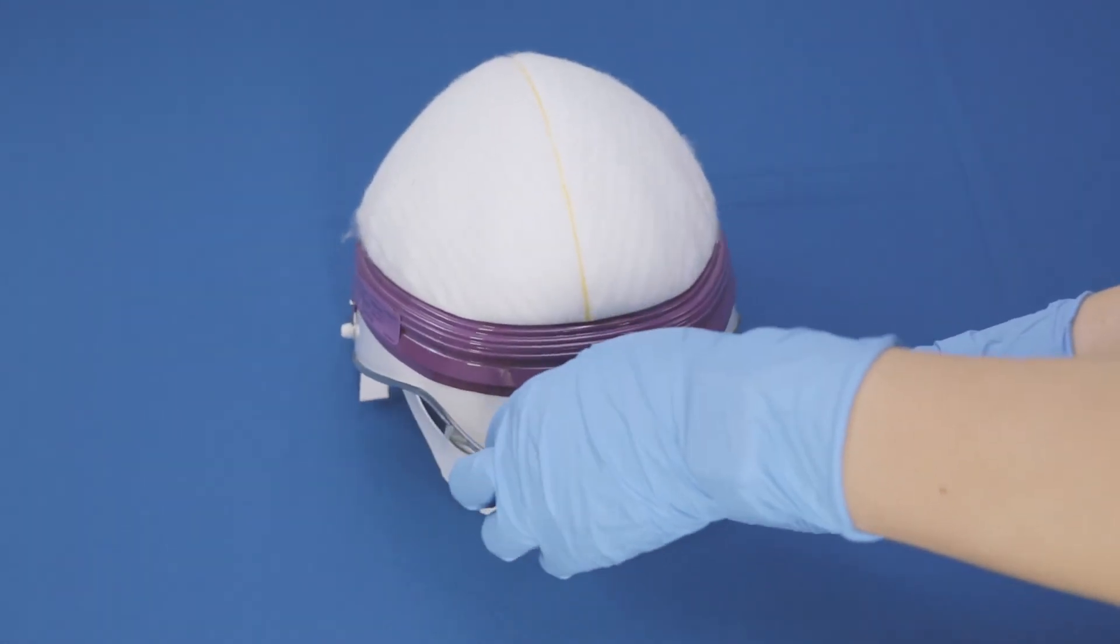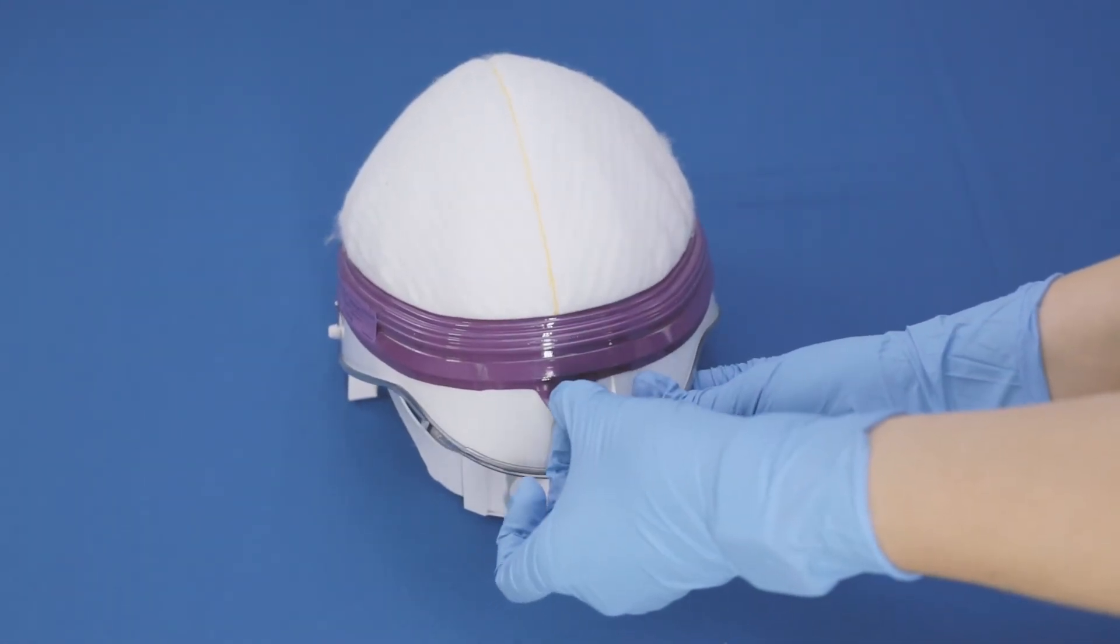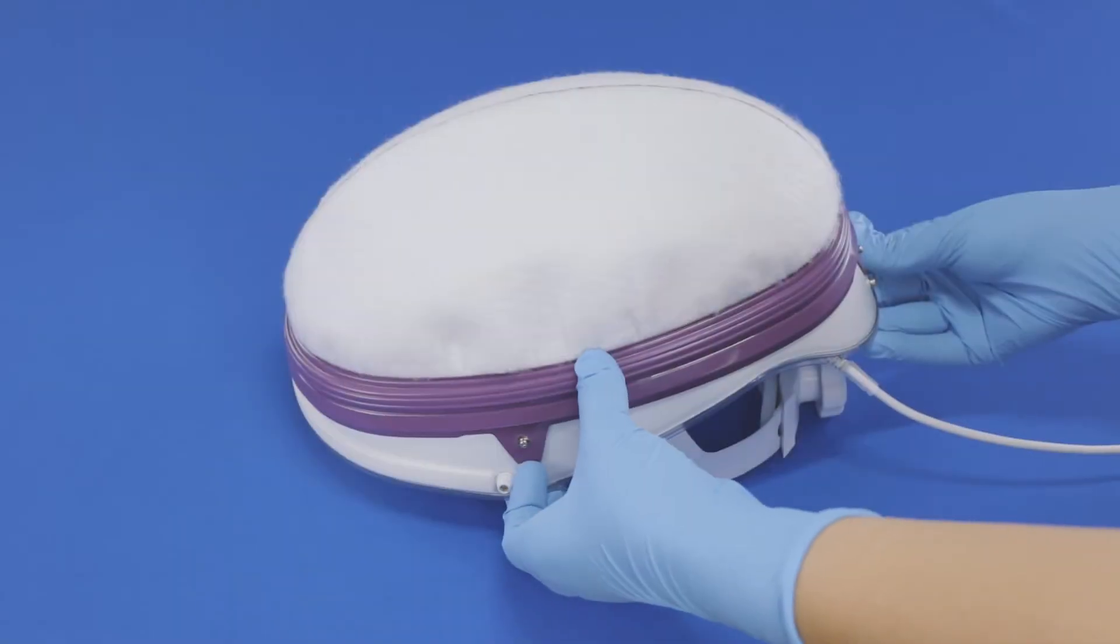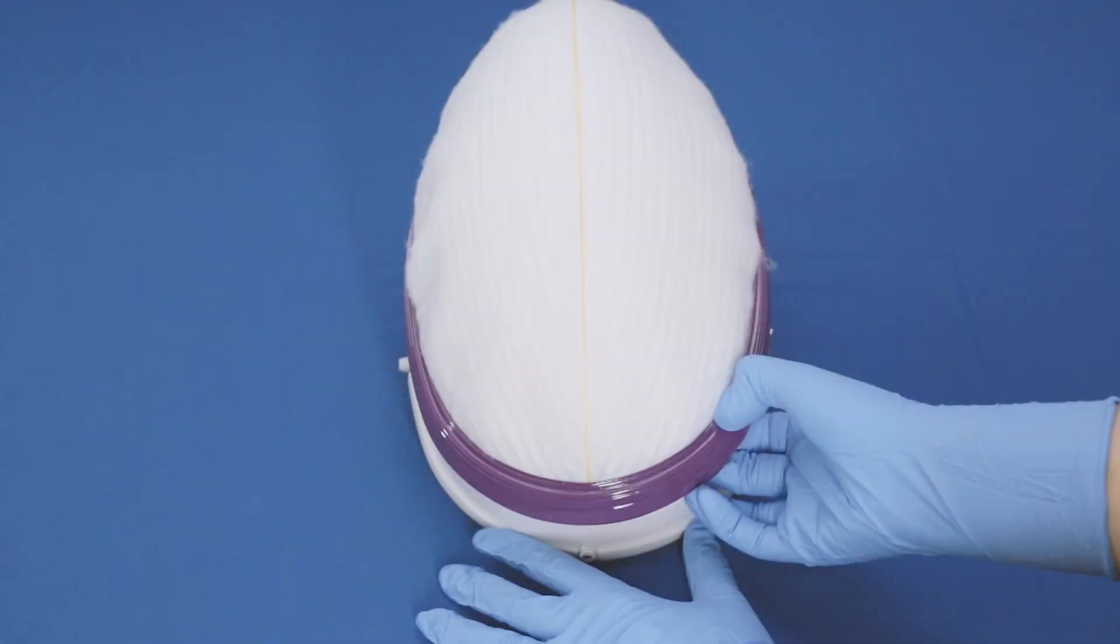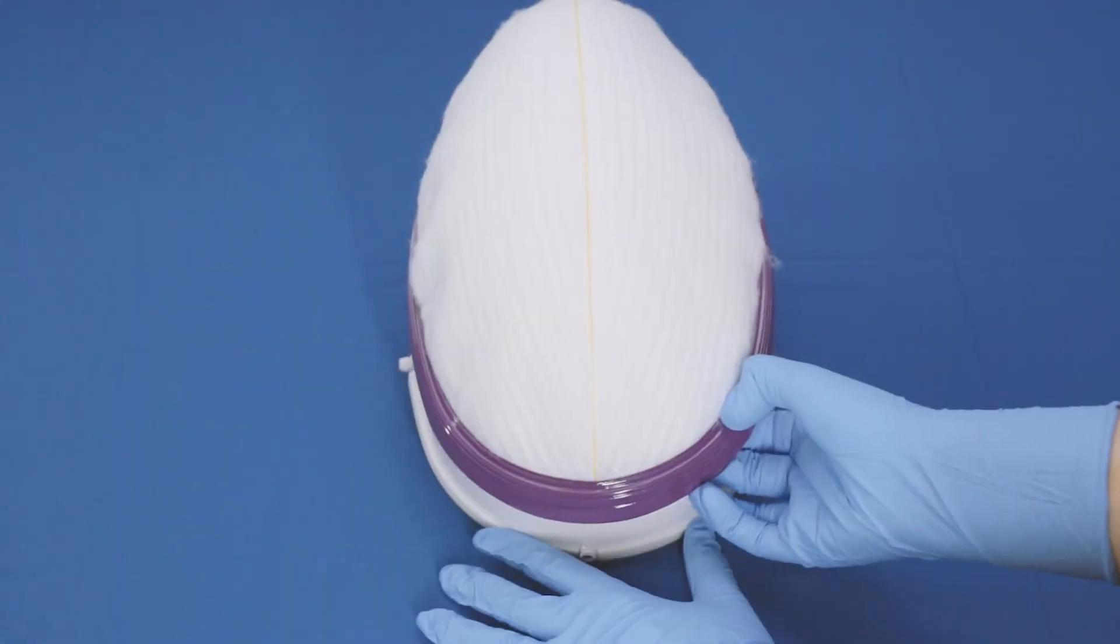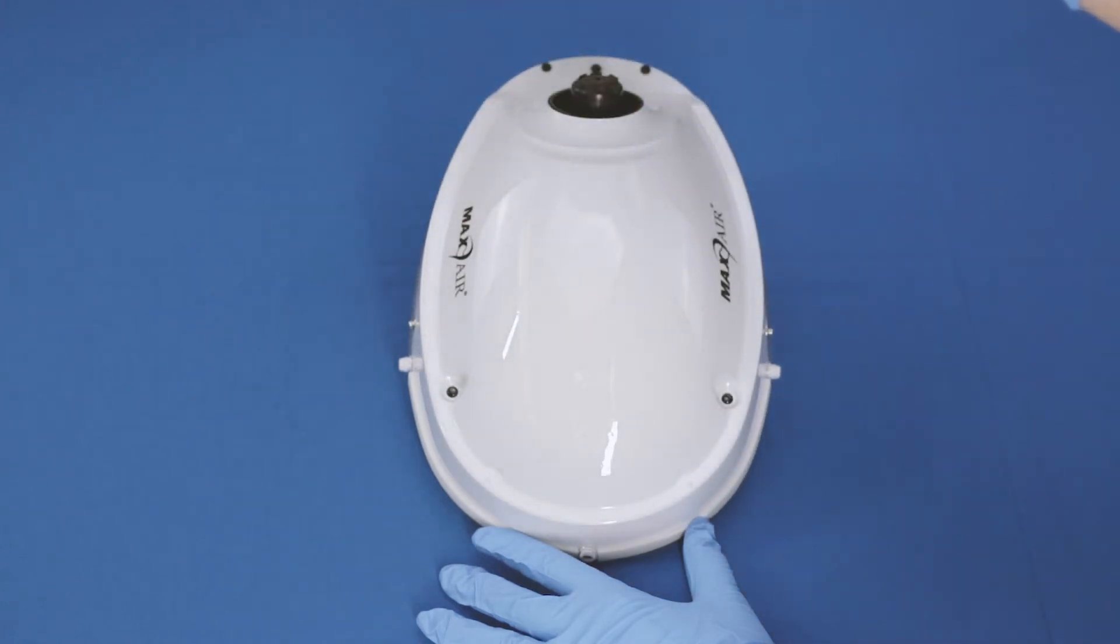To disassemble a filter cartridge, begin by unsnapping its magenta retainer ring rear and side tabs from the helmet. Then, while holding the helmet firmly, typically lift under the front of the retainer ring. Continue lifting the filter cartridge until it is completely away from the helmet.